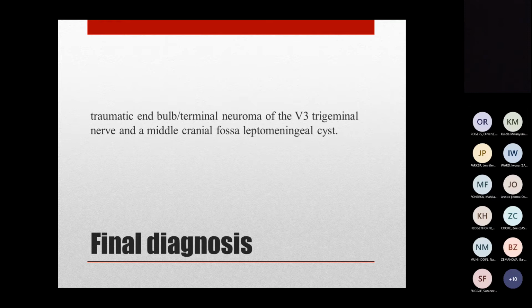The presumed diagnosis in this case, given complete absence of cancer and no history of surgery, is traumatic end-bulb terminal neuroma of the trigeminal nerve and a middle cranial fossa leptomeningeal cyst.